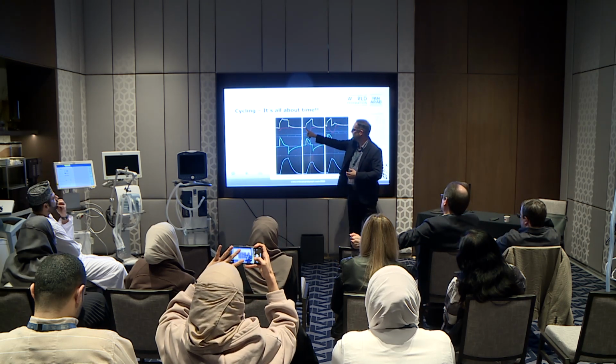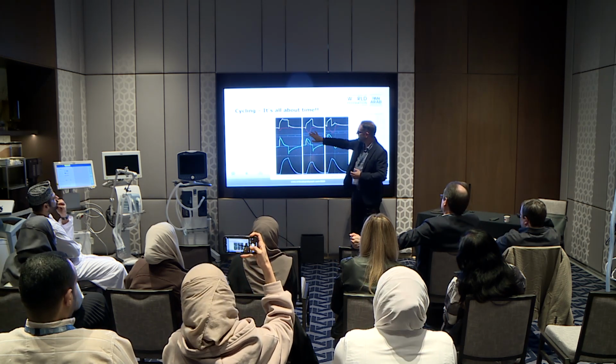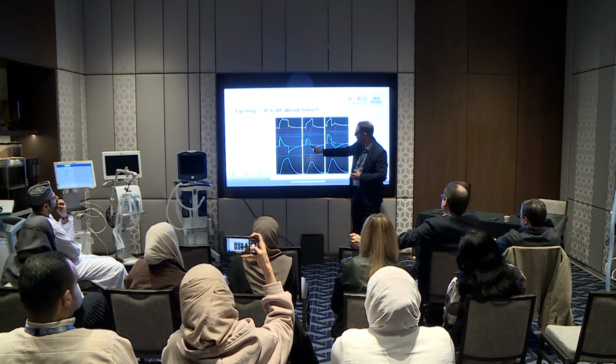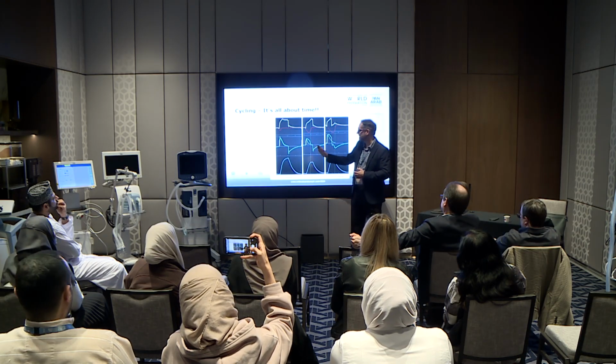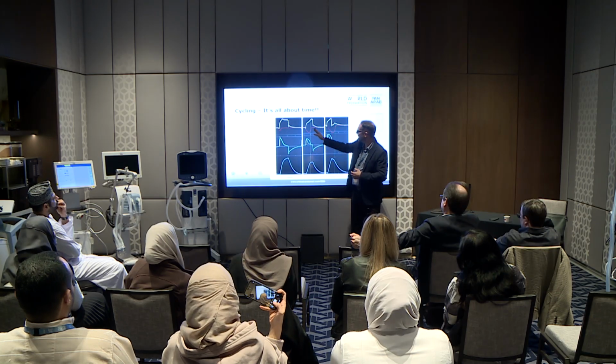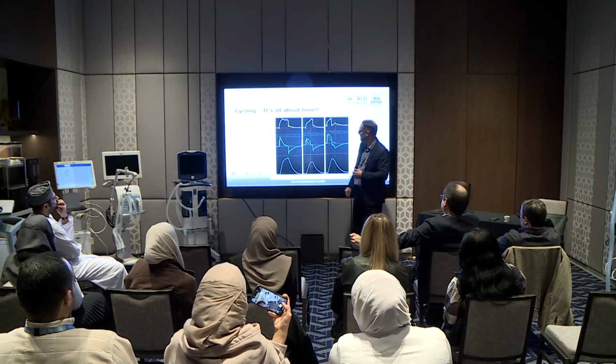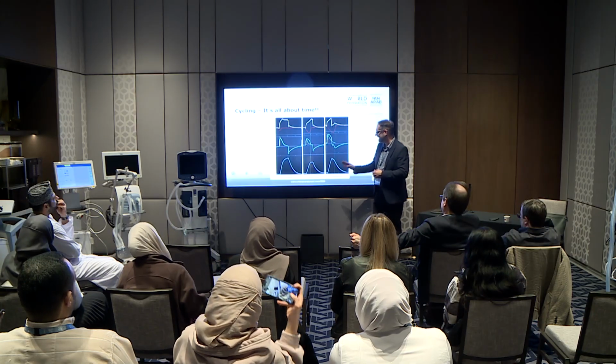In this one, you see the patient's taking a larger breath here, and this is where they start to exhale here. And notice how there's a pause. This means I've set a fixed inspiratory time. There's a pause in flow, and when that pause happens, you actually see this little blip up here, this plateau pressure. And so that's delayed or late cycle.